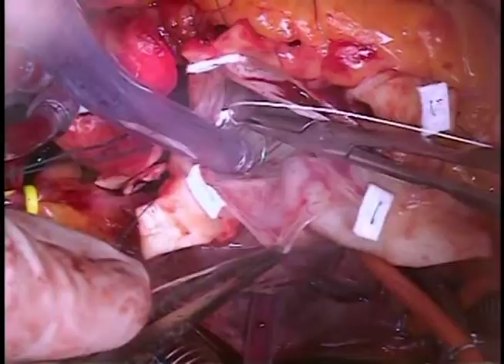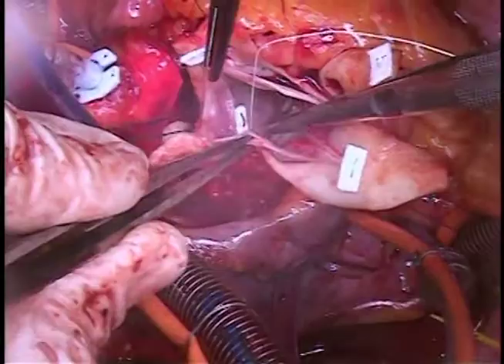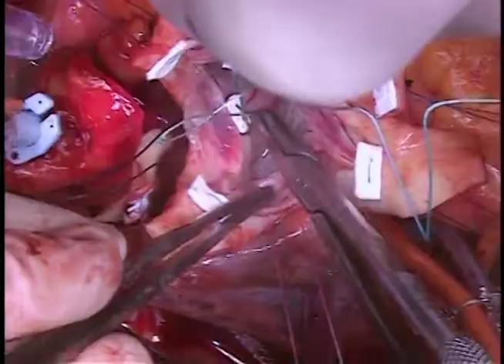Now we begin with pledgeted 2-0 subannular sutures. We place one at each nadir and one at each commissure, keeping these in the same plane. For a bicuspid valve, this is modified slightly. These sutures should be in the same plane to avoid encroaching upwards on the commissures.